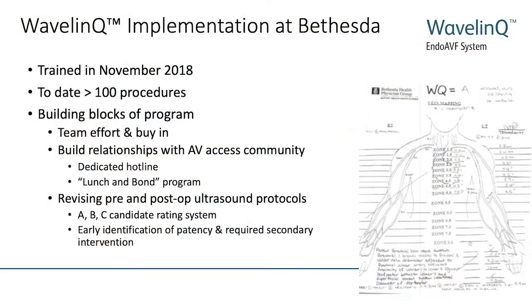George, I love your program, I love your protocol, and you did a great job explaining how you're looking at that. Now, the other thing that I failed to mention is that on our screen here, you have what we call our screening ultrasound map. What we do once we've decided to go to surgery is that we have a cleaned up, coned down operative map, which I take with me to the operating room when we hang it up on the wall.